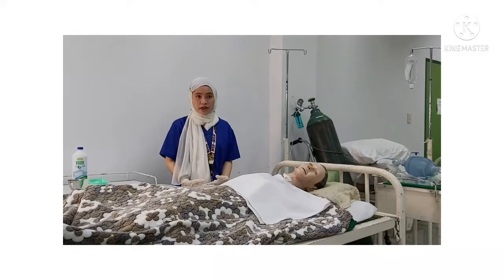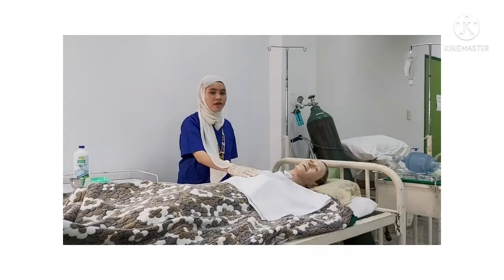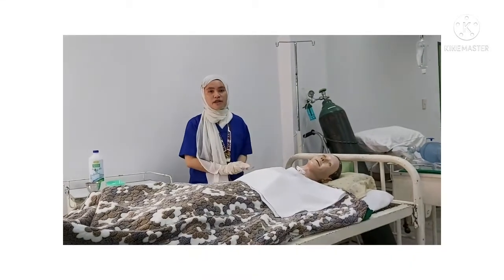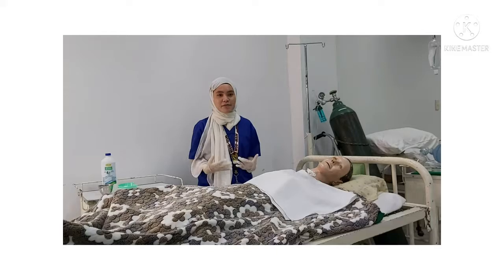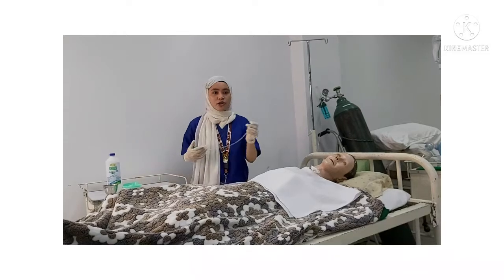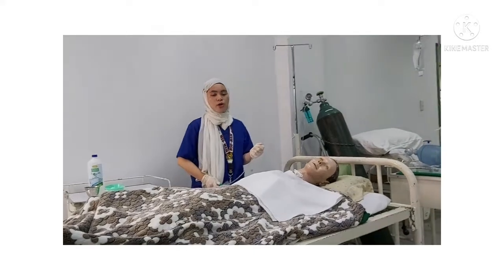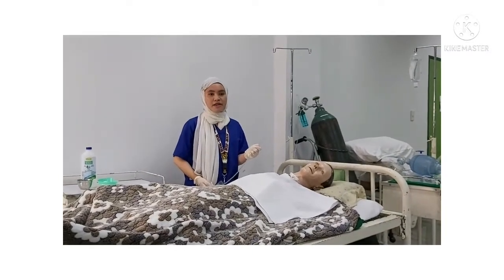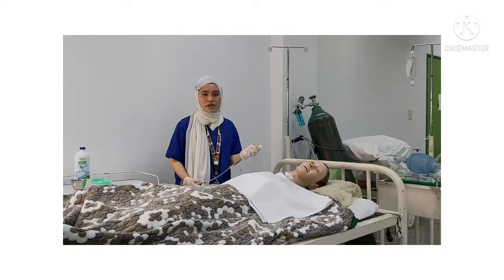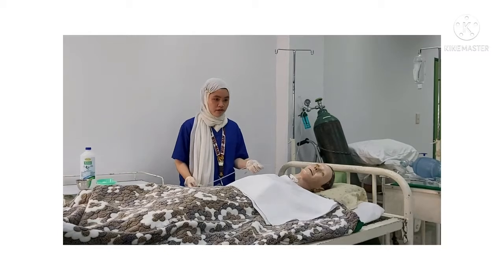And now for the endotracheal and tracheostomy tube suctioning. Hyperventilate the patient's lungs with a resuscitation bag before suctioning. This is to help prevent suction hypoxemia. Gently insert the catheter through the endotracheal or tracheostomy tube with the suction off by keeping the port open. This is to prevent tissue trauma and oxygen loss. Suction is not applied during the insertion of the catheter.